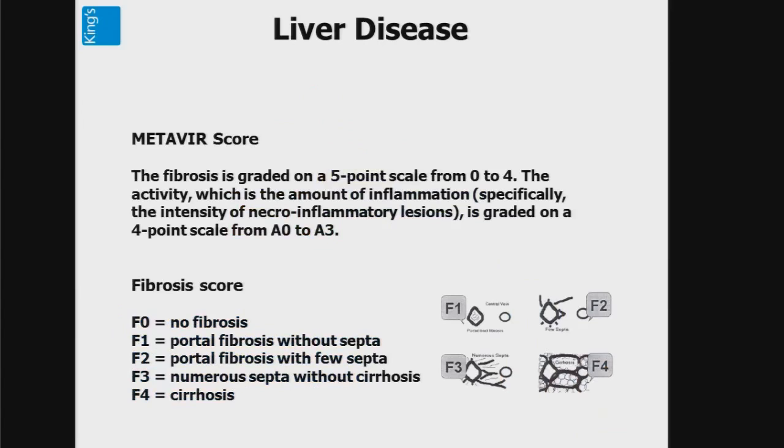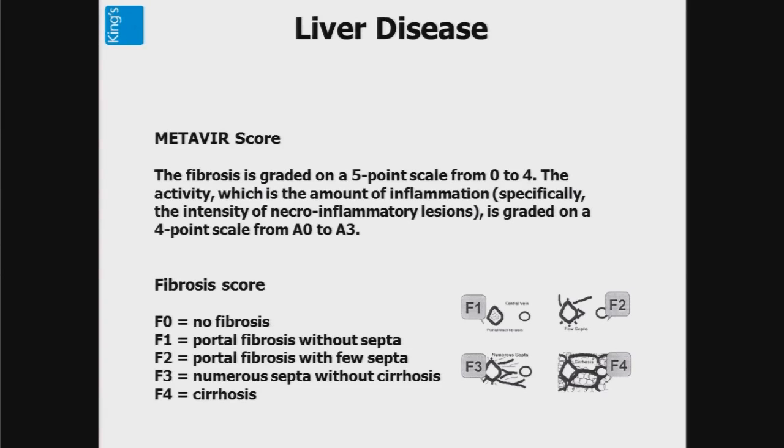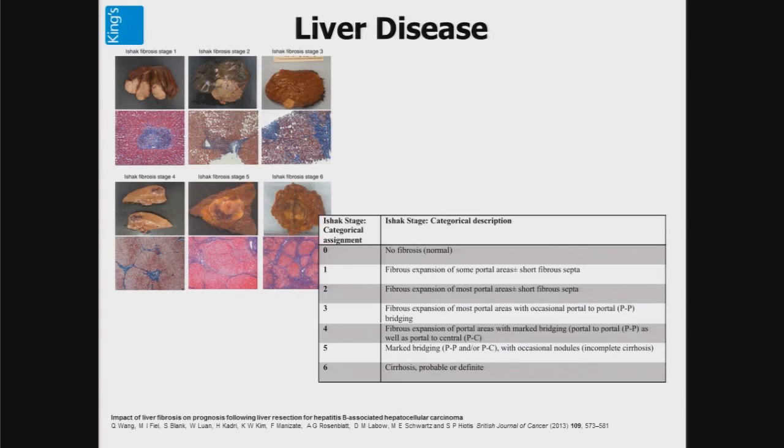There are several different ways of classification. The most popular way of classifying liver fibrosis is the Metavir score, which is divided into F0 to F4, where F0 is no fibrosis, as normal, and F4 is cirrhosis, with a spectrum of disease between the two. You're looking to establish whether this patient is F2 or above, or F4, to give disease-modifying treatment or monitor the patient. But also note that if you've got inflammation in the liver, you can classify that as well. It's important because inflammation in the liver affects your fibrosis score, your elastography score.